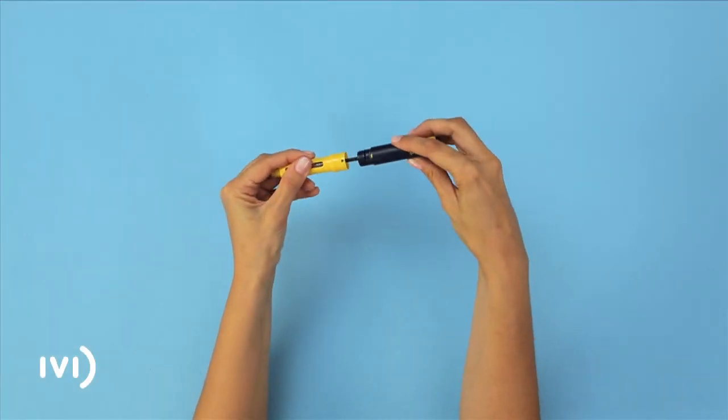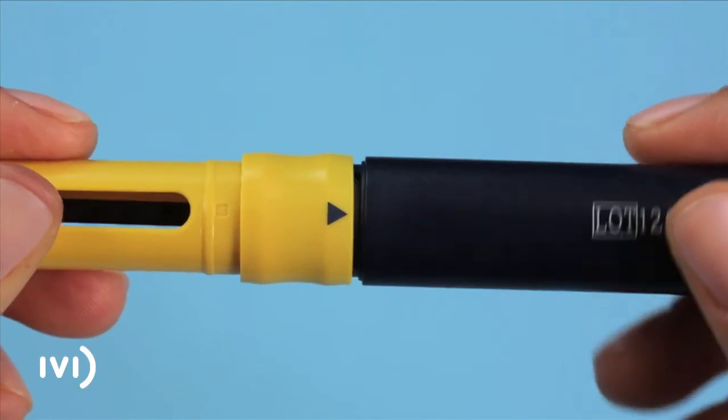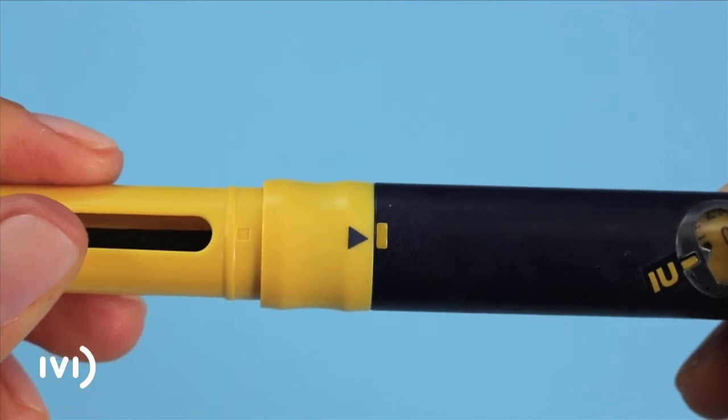Slide the Puragon cartridge into the yellow base with the metal end going in first. Screw the blue part of the pen onto the yellow base containing the medication, making sure that the arrows line up with the mark.